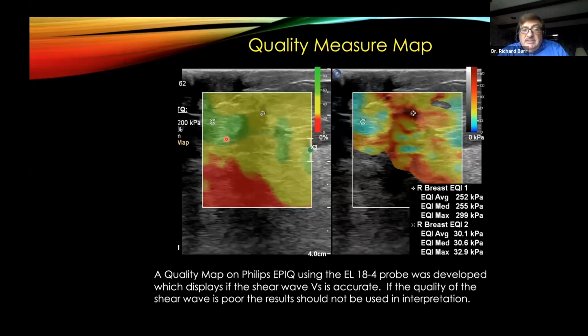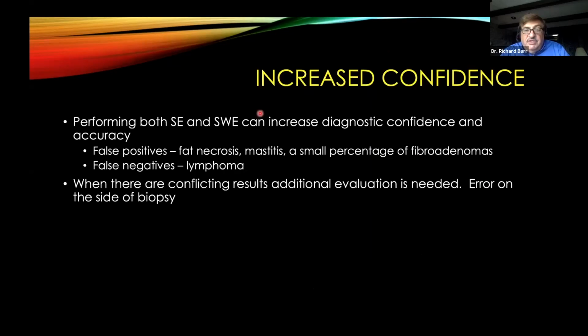And again, this is the same map that we're using in the liver. And again, we want to take measurements where they're green. Here I actually took it where it's yellow. This is another malignancy. You can see over here, the stiffness value that is the highest is actually in the tumor. And even though it's yellow, I went ahead and did our measurements.